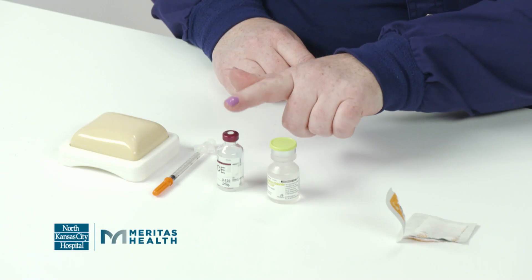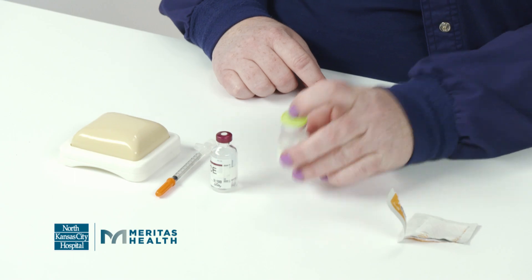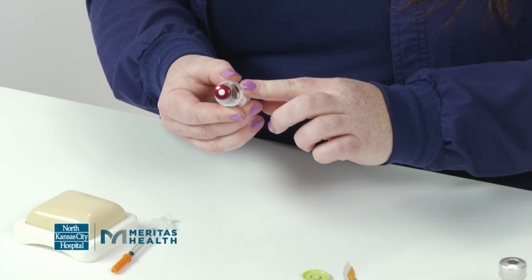I'm going to show you how to give insulin with a bottle of insulin and a syringe. When you first get your insulin, it'll have a cap on the top and you want to make sure you flip the cap off. It'll look like this after you do that.